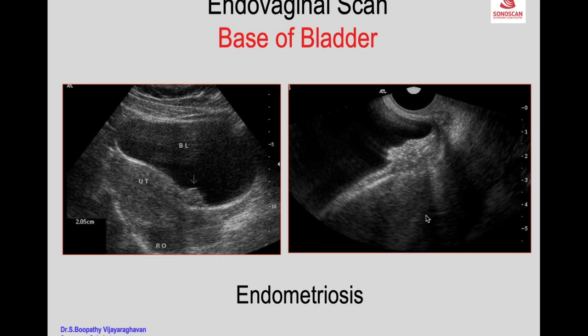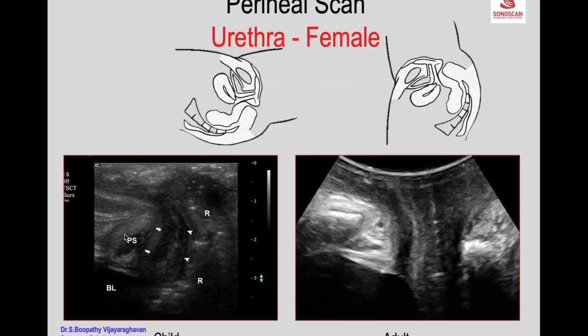You see the uterus and bladder, and you see the irregular mass at the level of the LSCS scar with loss of interface between the uterus and the bladder, and actually irregular mass protruding into the bladder, pubic symphysis, and you see the bladder and the urethra. So that is the bladder and the urethra, and then you see the vagina. So that is the vagina, and this is the rectum.